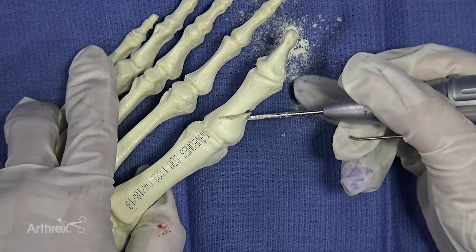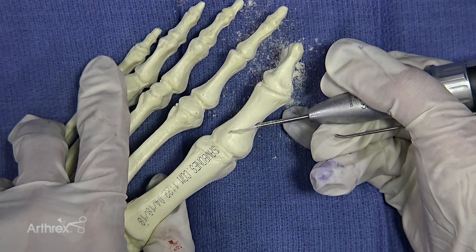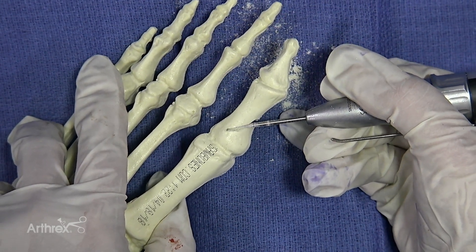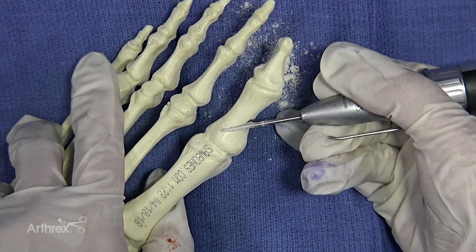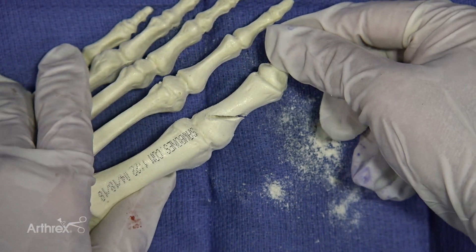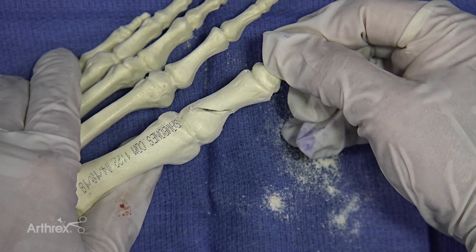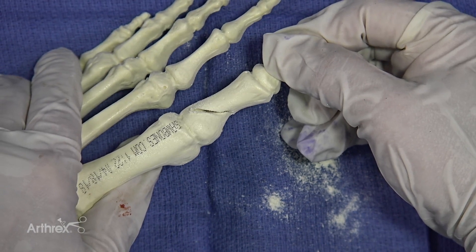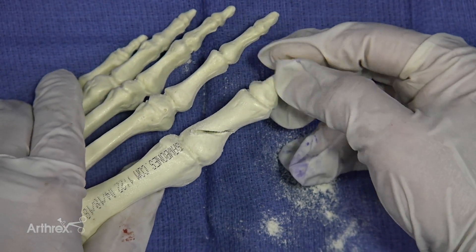You could maybe cut a little bit more in order to facilitate closing the wedge — sometimes that's necessary in real life. You can basically correct your osteotomy and close the wedge like so. If you feel like you need a little bit more correction, you can take a little bit more off of that wedge.